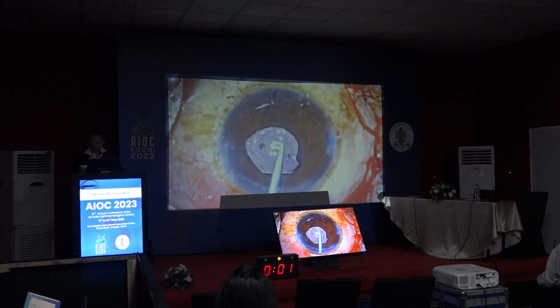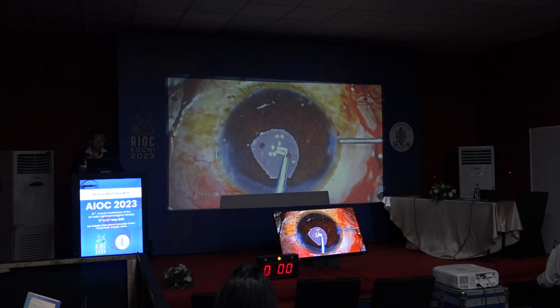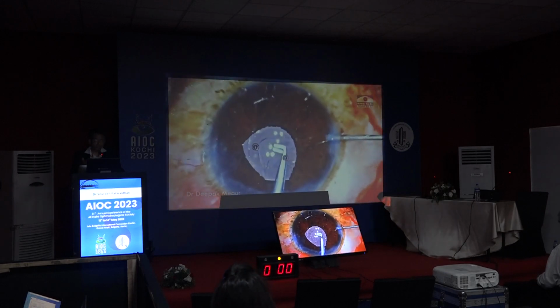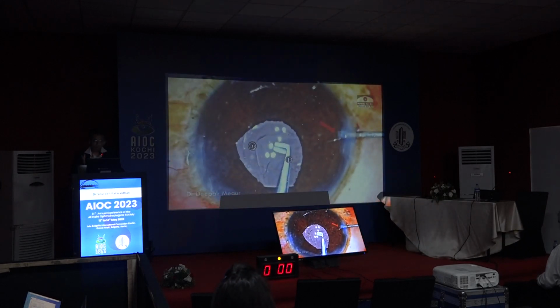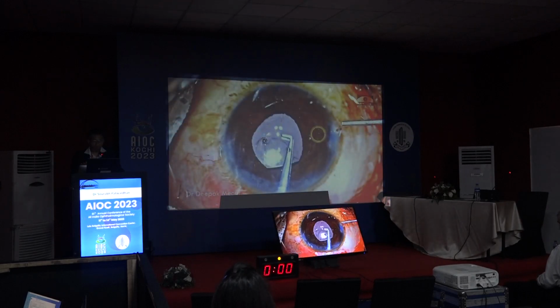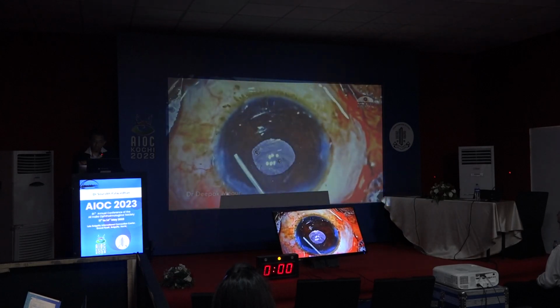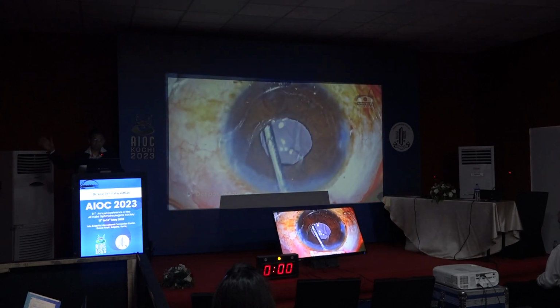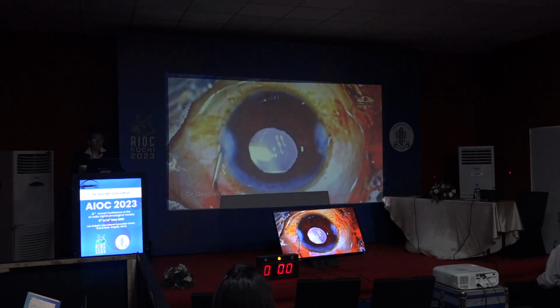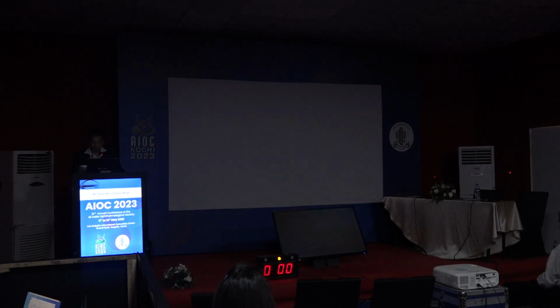The same thing: you hold the lens in that particular position so that you know where to tap on the iris. Again, the lens is pushed forward, and the blunt cannula ensures that you just tap it down, and you can see the pucker happening. Ideally, the enclavation has to be done in the mid periphery or as far in the periphery as possible. This prevents ovalization of the pupil, which can happen. So this was one case.